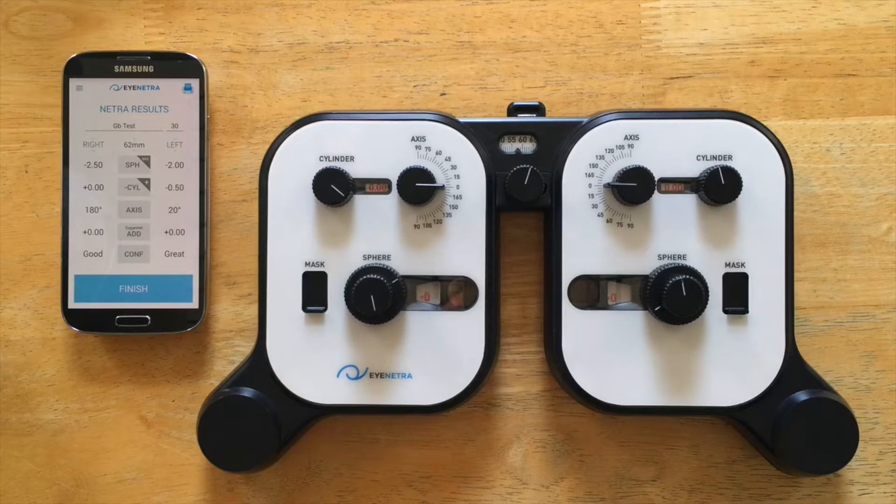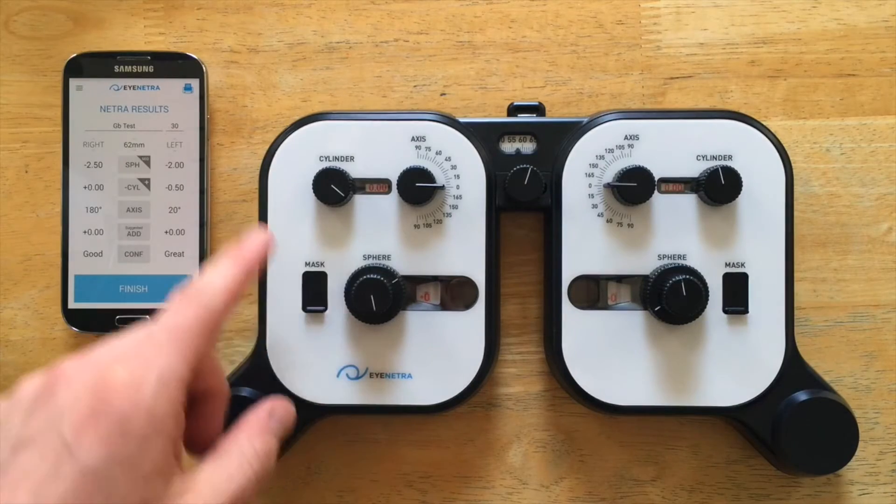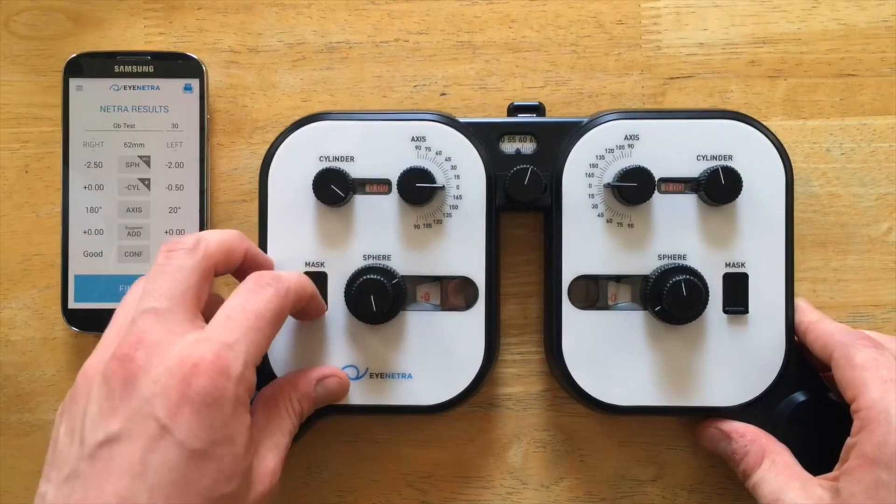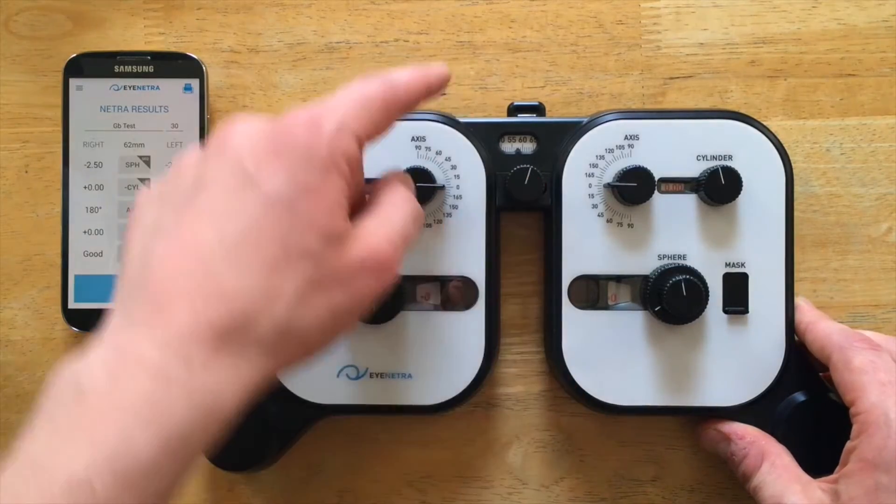It contains a full range of custom-made spherical and cylindrical lenses, along with axial control, occlusion capabilities, as well as a knob for PD and a PD lock.